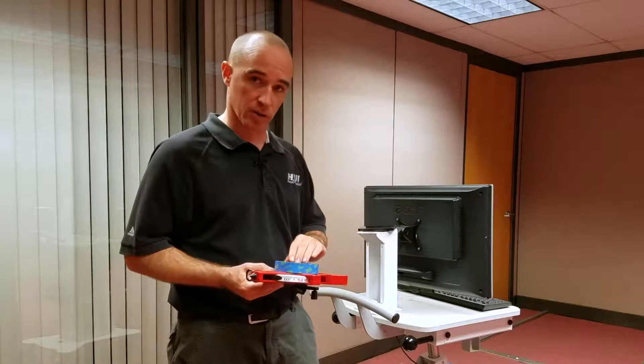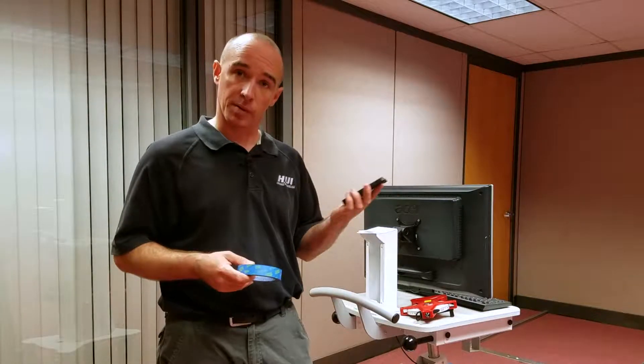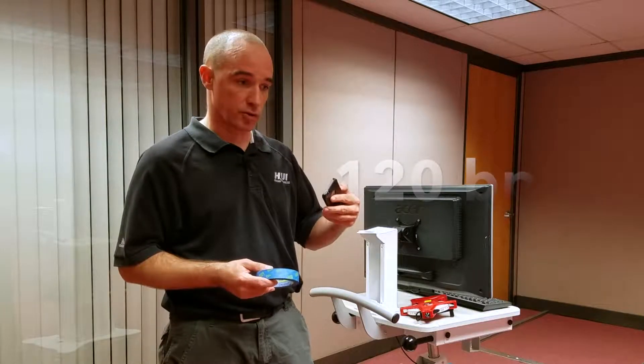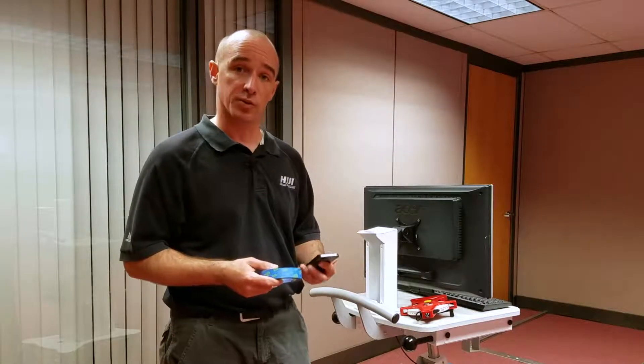Starting out at the threshold, I lay out my tape measure and make a mark at every 0.4 meters. I play on my metronome a beat at 120 beats per minute. So as I am transporting the cart and make a step onto each mark with each beat, I'll be going over the threshold at 0.8 meters per second.